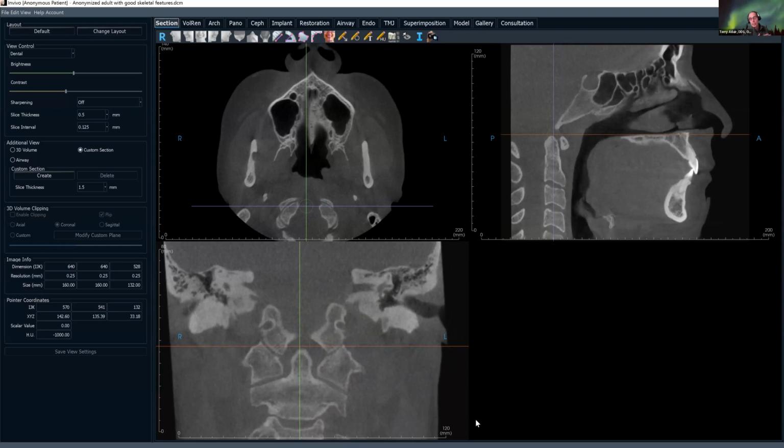If you have decreased space there, commonly you're going to see this more often in older patients, where you have sort of that compression of those vertebral spaces. You're going to see the development of arthritic changes, sclerosis, or maybe osteophyte formation. So these are all things that we want to keep our eye out for. This right here is maybe not the best example, but this right side might be a little bit better.